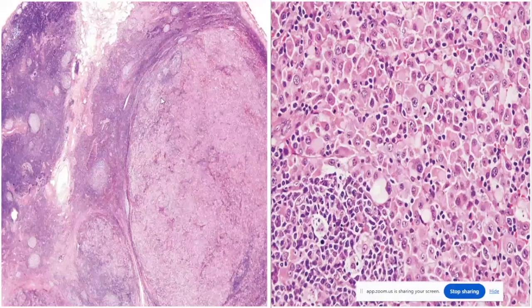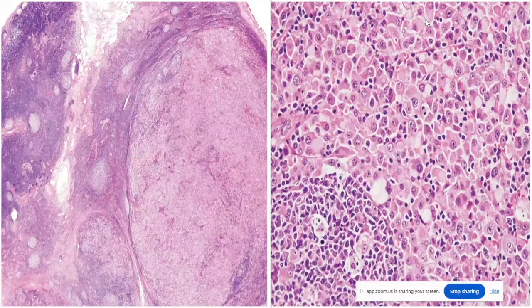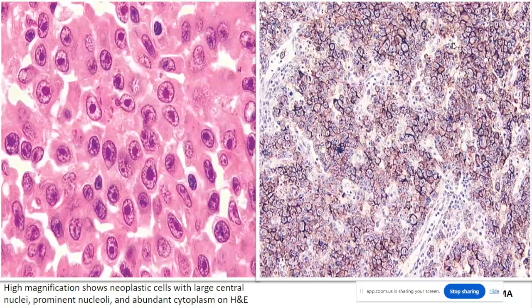On the histomorphological image, an effaced architecture is the one thing I'm seeing at low power. At high power, I see medium to large size cells whose nuclei are eccentrically arranged — possibly plasmablastic morphology. The nucleoli are prominent, which looks like plasmablastic morphology to me.